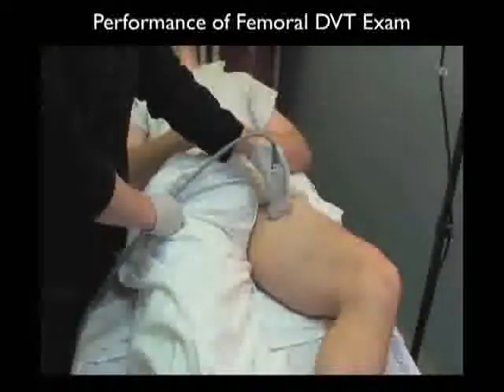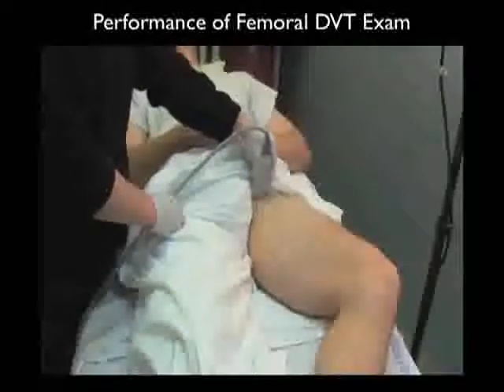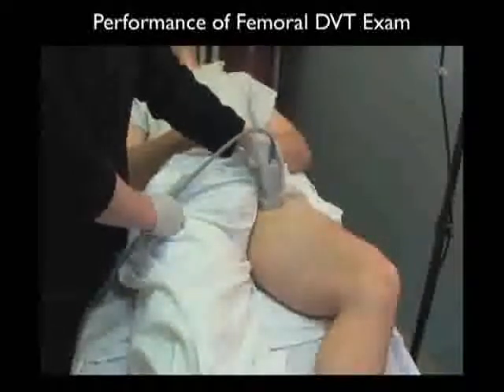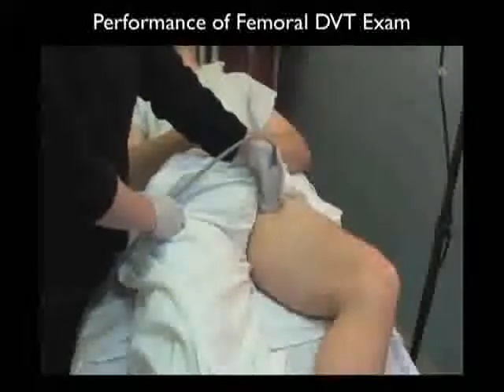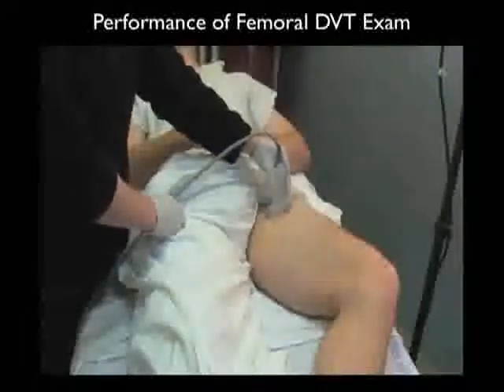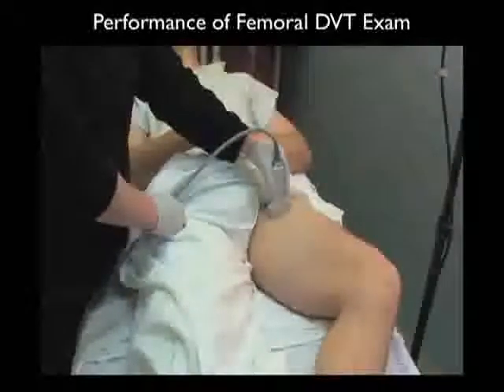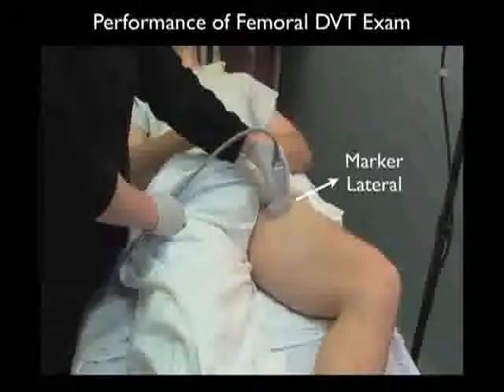Notice that we're sequentially compressing at different levels along the common femoral vein, compressing from the beginning at the top just below the inguinal ligament, all the way down through bifurcation into the superficial and deep femoral vessels. Now a clot will not completely compress with pressure down with the probe and thus will be identified on bedside examination. Notice here, it's standard to have the marker on the probe going lateral so that we know where we are with regard to the orientation of the probe versus the screen.